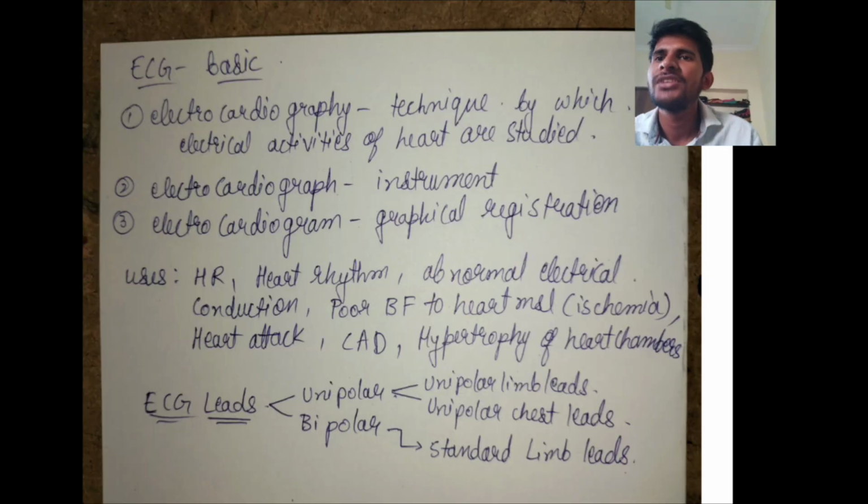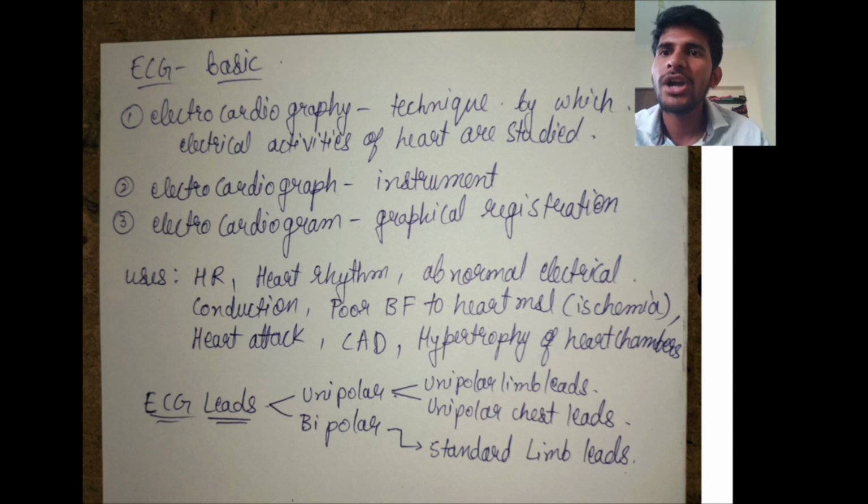First, ECG basics. There are three terms: electrocardiography, electrocardiogram, electrocardiograph. One twist is that electrocardiogram is the graphical representation. Electrocardiograph is the instrument. Electrocardiography is the technique in which the electrical activities of the heart are recorded or studied.